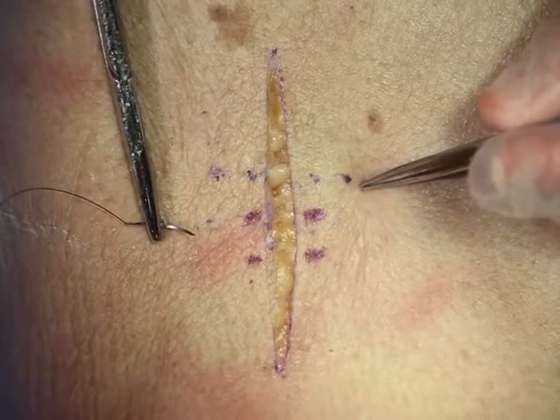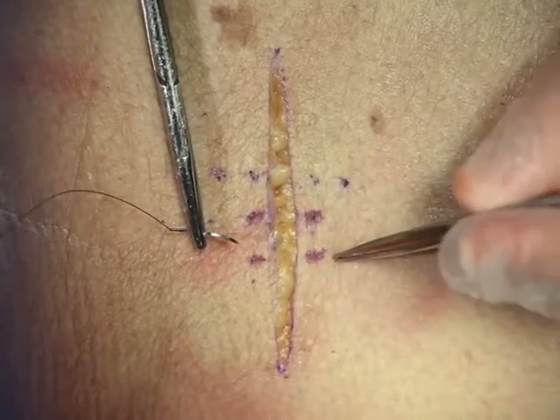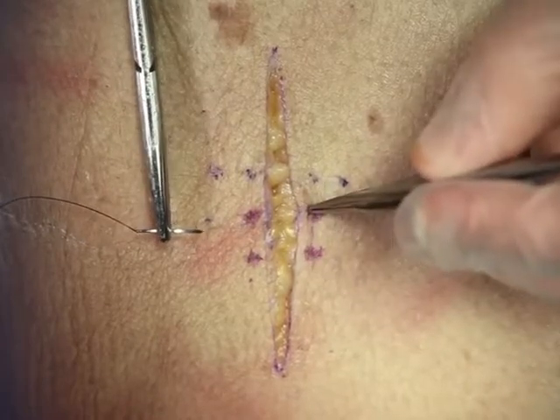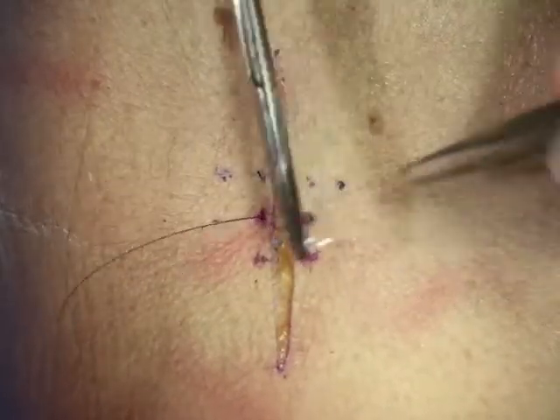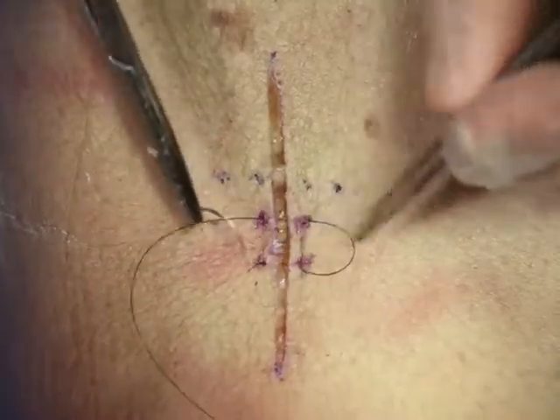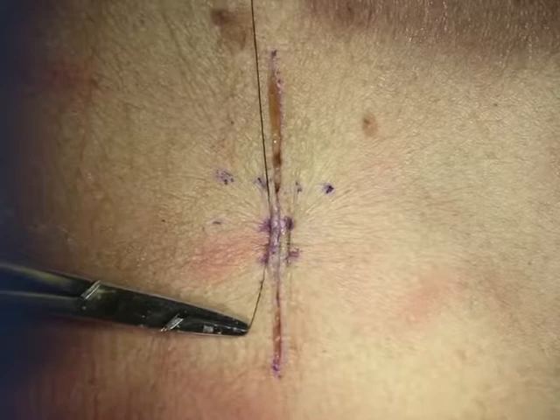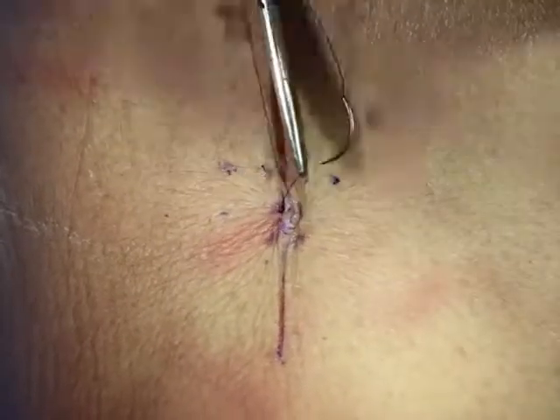Our next suture is the horizontal mattress suture. Its configuration is horizontal as opposed to our vertical mattress. You can think of this as two simple sutures — in some sense it's a simple suture, it just saves you time. It's important to stay close to the skin edge and remain the same distance on both sides. You'll take your bite on one side and then the other, turn it around, and go back so you end up on the same side. The advantage of this is speed compared to doing simple sutures, though it doesn't evert as effectively as a vertical mattress sometimes.